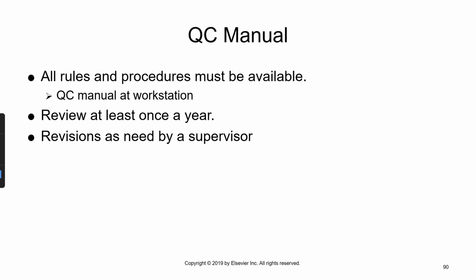All rules and procedures must be available in a QC manual. The QC manual must be at each workstation. Review it at least once a year, with revisions as needed by a supervisor.